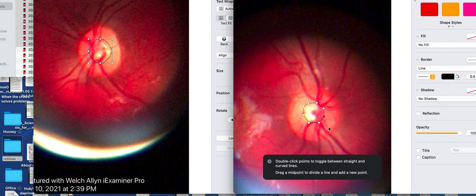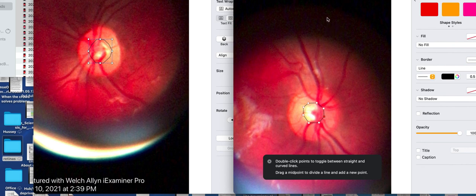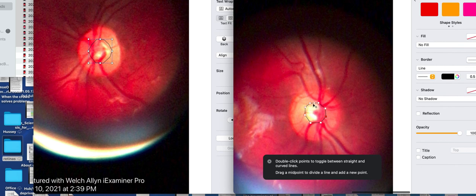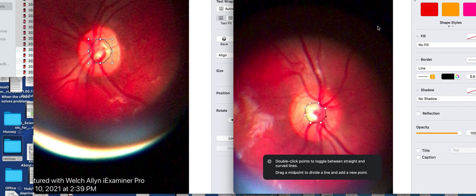When I look at these pictures in the future, I can transfer the picture with the circle, then duplicate the circle and transfer that to a newer picture and see if we're seeing a lot of change. That's how I manipulate images. I think it's a pretty handy tool.